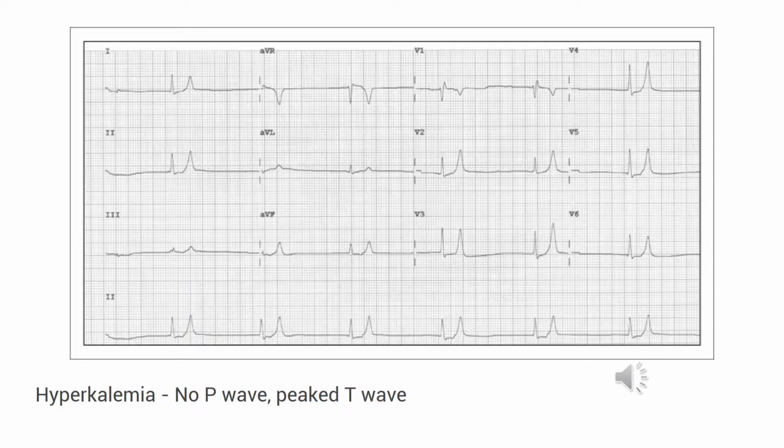So as was mentioned a few slides back with the QRS, P wave, all that stuff, this 12-lead EKG strip shows in lead 2 at the bottom a very peaked and narrow T wave and no P wave. And I mentioned before that we couldn't find any regularity notes on this, but this appears to be pretty regular, although this is just one strip. It's not obviously an exhaustive list of what other hyperkalemia EKG strips will look like.